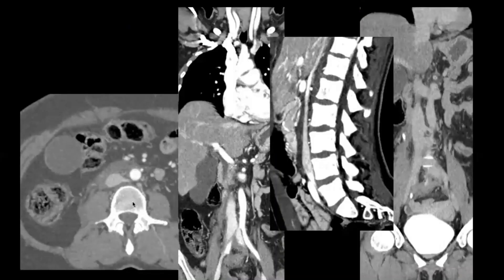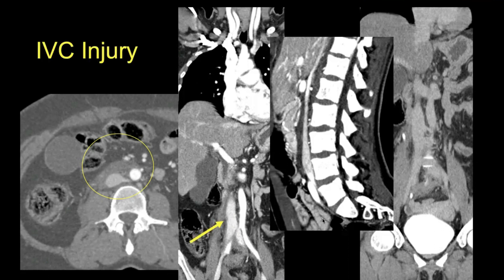Another example, a little bit more subtle: there is retroperitoneal stranding surrounding the IVC. Note a slight irregularity of the IVC on the right side and anteriorly, as well as mild thickening of the IVC wall. This surgically-proven injury did not require repair.